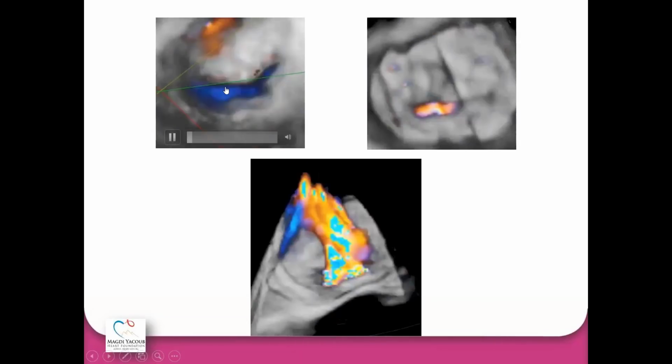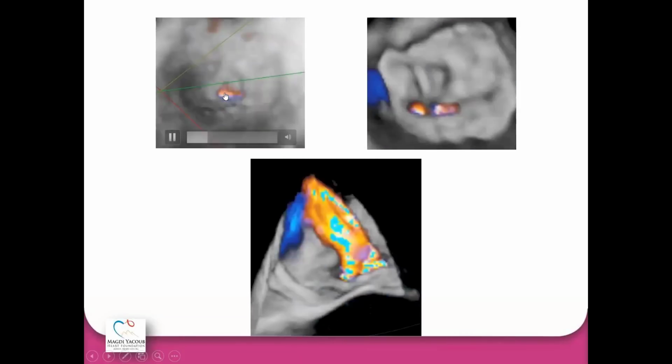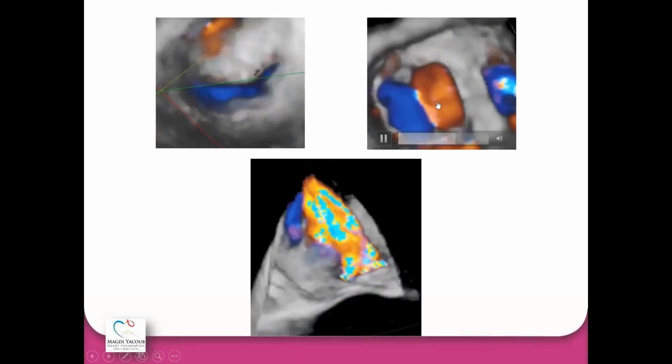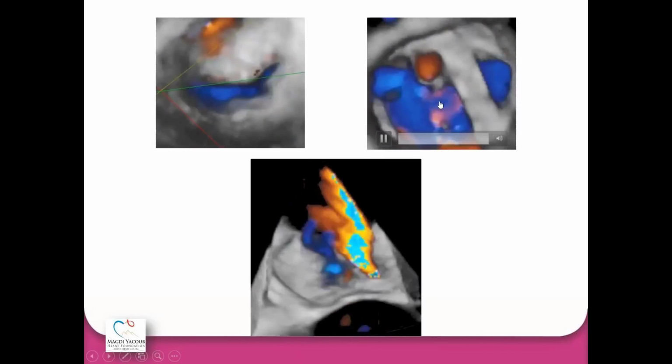That means grasping should be at the central part of the mitral valve, A2 and B2. On the other side, you can see another patient with a medial jet. So grasping in the middle will not help this patient. Here we can say that we should grasp medially.